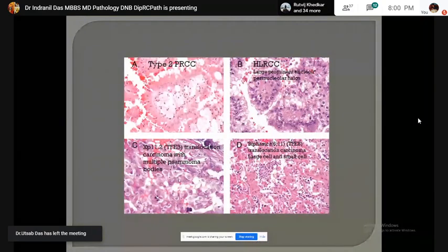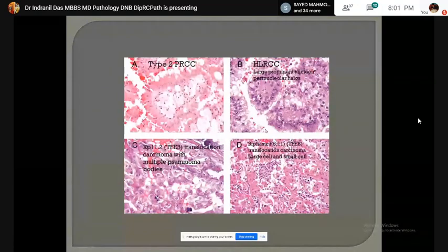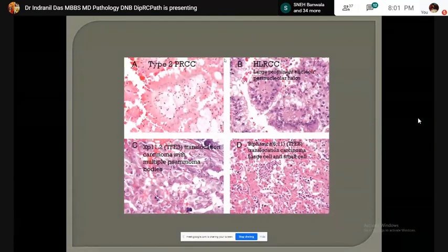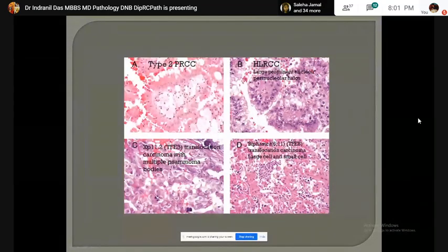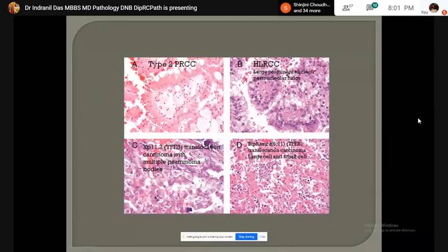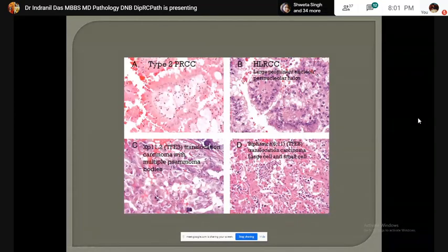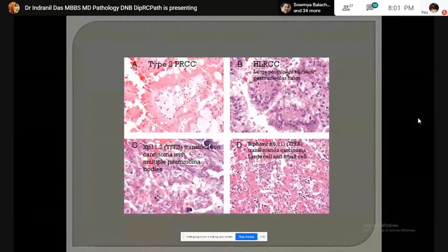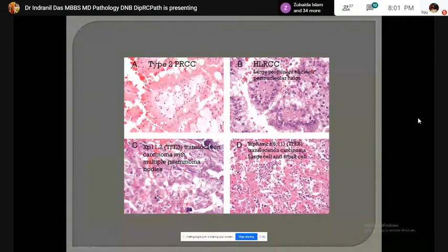This picture shows all the tumors in the differential diagnosis of renal tumors with papillary architecture: type 2 PRCC, hereditary leiomyomatosis and RCC-associated RCC showing prominent nucleoli, Xp11 translocation carcinoma showing psammoma bodies, and 6;11 translocation carcinoma showing a biphasic pattern of cells with abundant eosinophilic cytoplasm and clusters of small cells with hyperchromatic nuclei and scant eosinophilic cytoplasm.